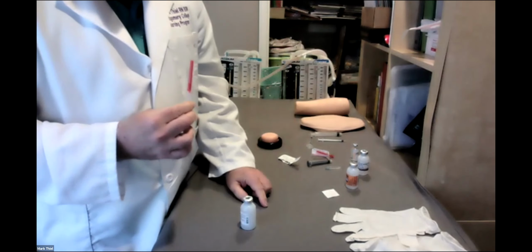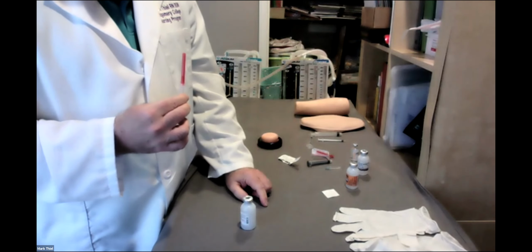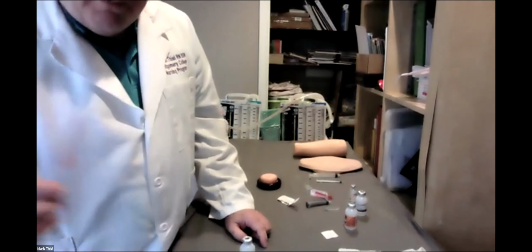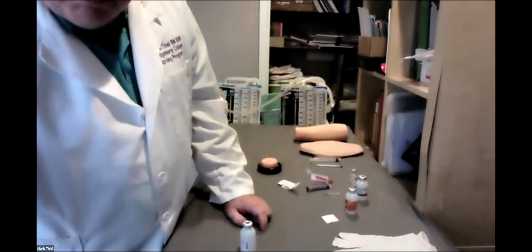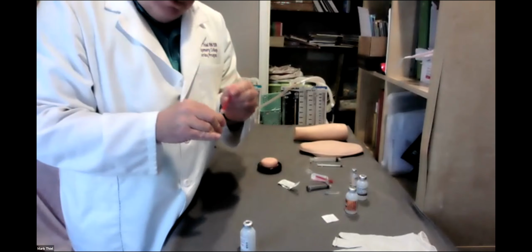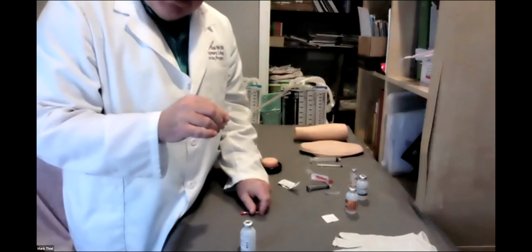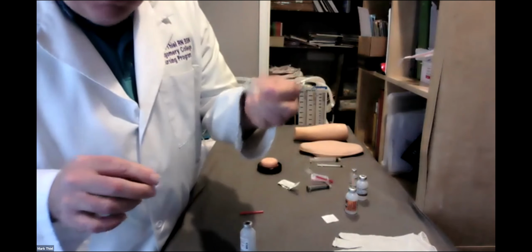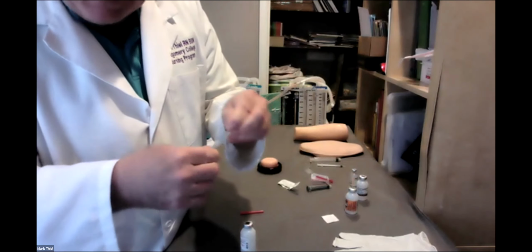Ready? Today, I've chosen my 23 gauge, 1 inch, my favorite personal intramuscular all purpose needle. Blue is the hub color. Remove my blunt as I described. Replace with my 23 gauge.